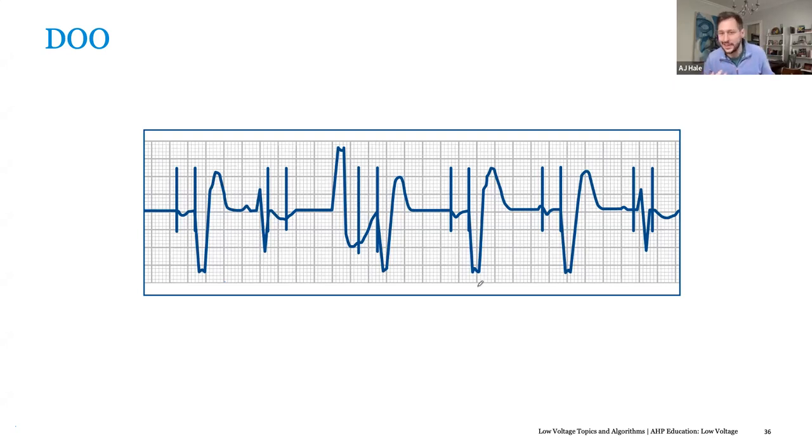I've only ever heard it called a VDD lead. I know it has a model number, but I don't know it. In the UK, Medtronic call it a single pass lead. But it's not something that a lot of people tend to do because it has a habit of falling out. Normally when it detects the P wave, the P wave sensing value keeps going down because it's dangling in the atrium. Whereas a normal active fixation or passive fixation lead is in a fixed position. So single pass or VDD leads have a habit of displacing.